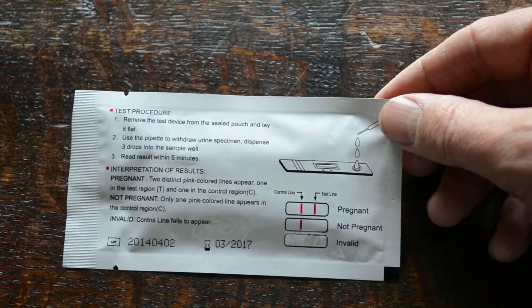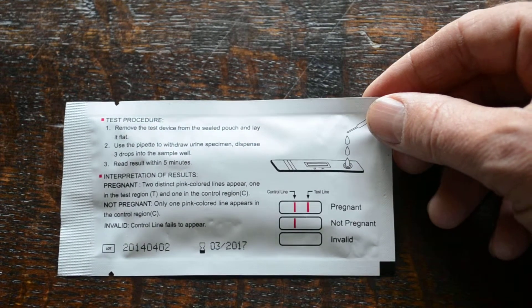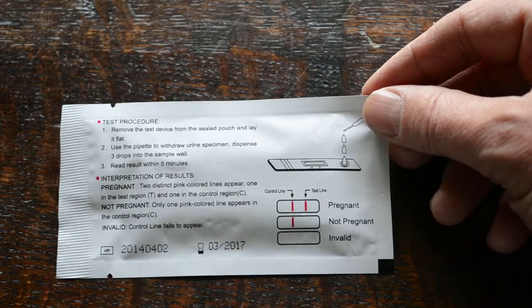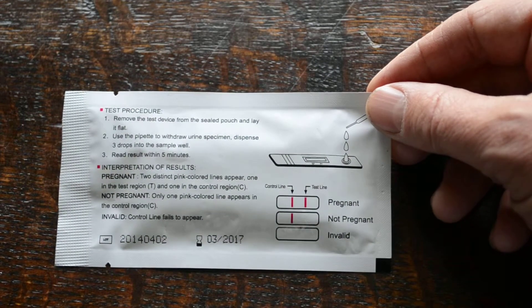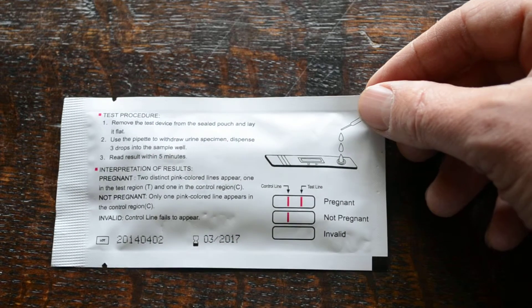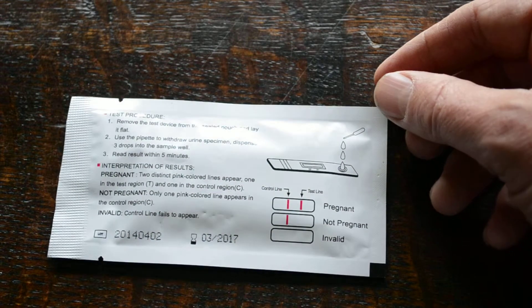On the reverse of the foil you've got some very easy to follow test procedures. Remove the test device from the sealed pouch and lay it flat. Use the pipette packed in with the test cassette to add three drops of urine, then read the results at five minutes.